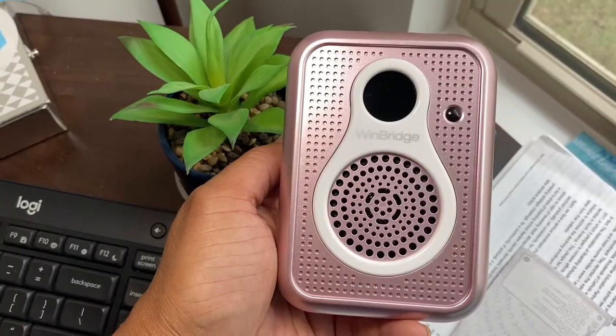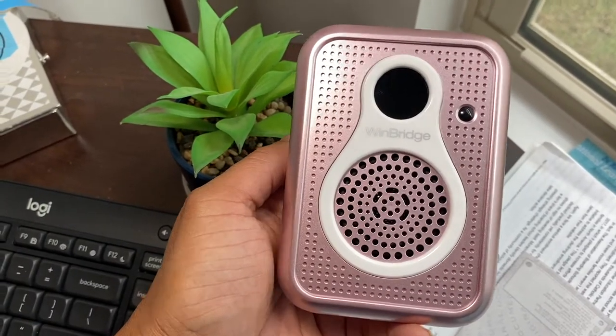Now what I do love about this — because you know I'm a girl and a girl likes pretty things — it is rose gold. That's right, it is rose gold and I absolutely love the color. If you go back and watch that other video, you know the other one is just kind of black and chunky, not inspiring to use whatsoever. But this one, I love the color.